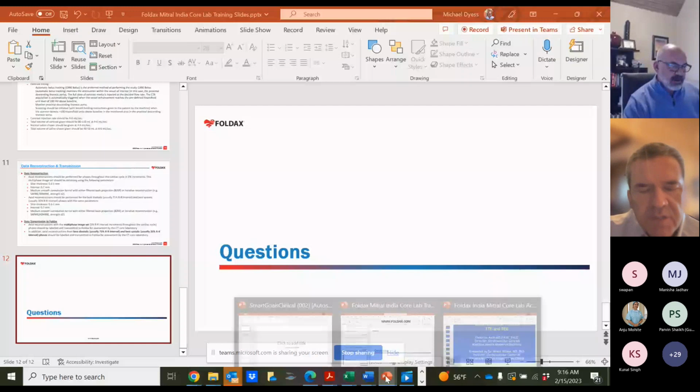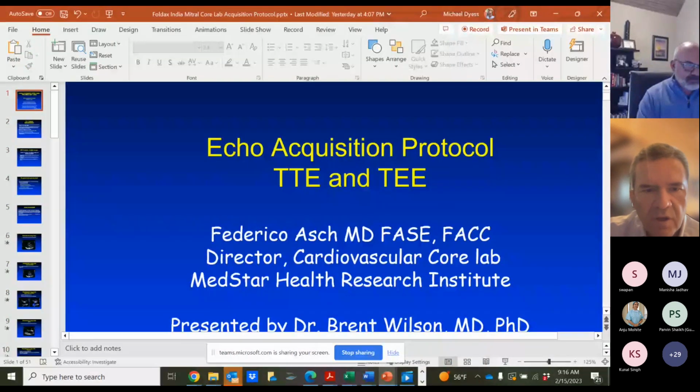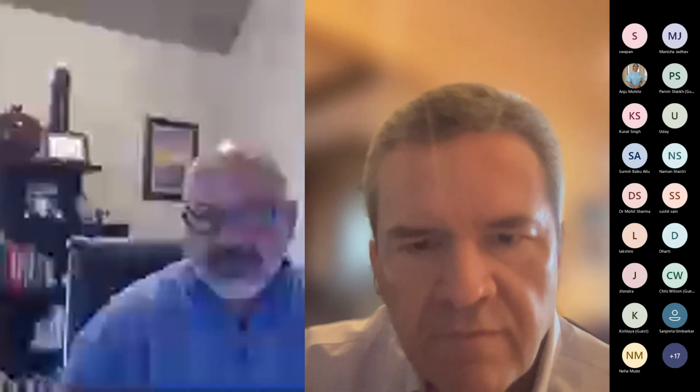I guess, Michael, some of the biggest things are, one, to choose the appropriate imaging window, to make sure that the ECG gate is working well. And then also just to make sure the patient has good instructions so that we get images without motion artifact and that the heart rate is regular. I think with that, we'll get high quality CT images.